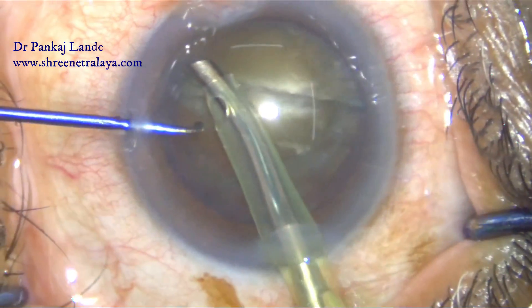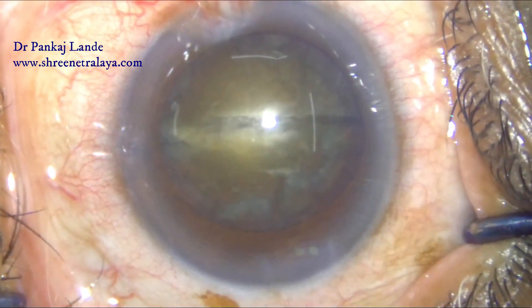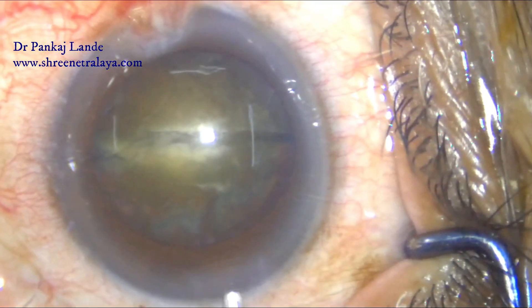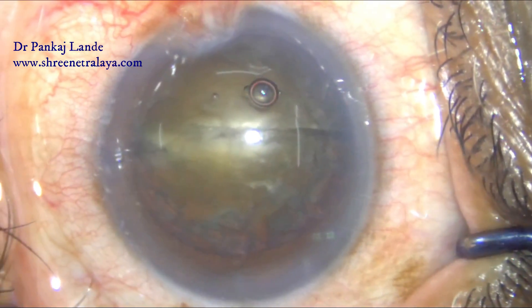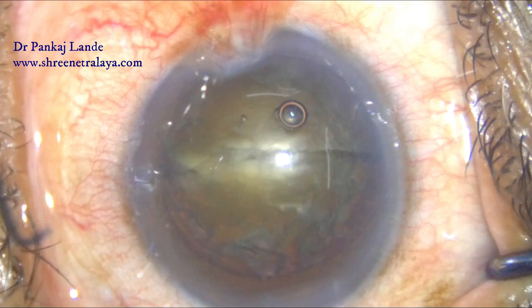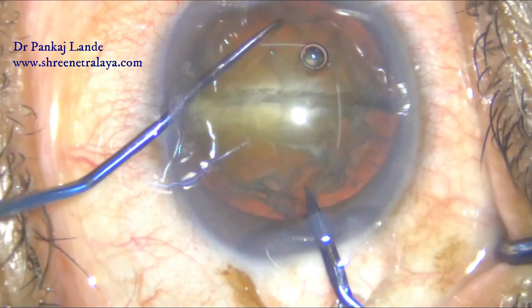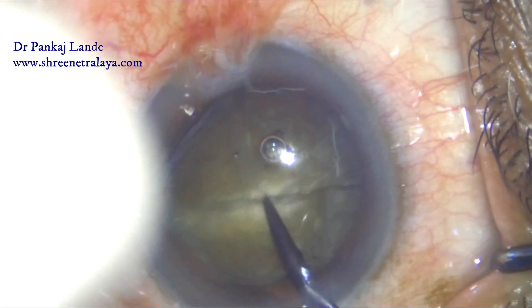I decided to debulk the bag to get more space for the pre-chopper to use conveniently. I went with the phaco handpiece and removed the cortical matter with the help of phaco aspiration in foot pedal position two. Now I have enough space to use my pre-chopper again; I reformed the anterior chamber with viscoelastic.